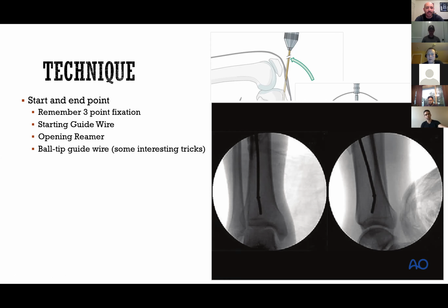I was just going to point out that that guide wire has too acute a bend. You want just a slight bend to help you facilitate which direction you're rotating your guide wire to get that perfect placement. But if you have too big of a bend, like in this case, once you insert your nail over your guide wire, you're going to have a hard time getting that guide wire out because the angle of the bend is too big to fit through the inner diameter of the nail.